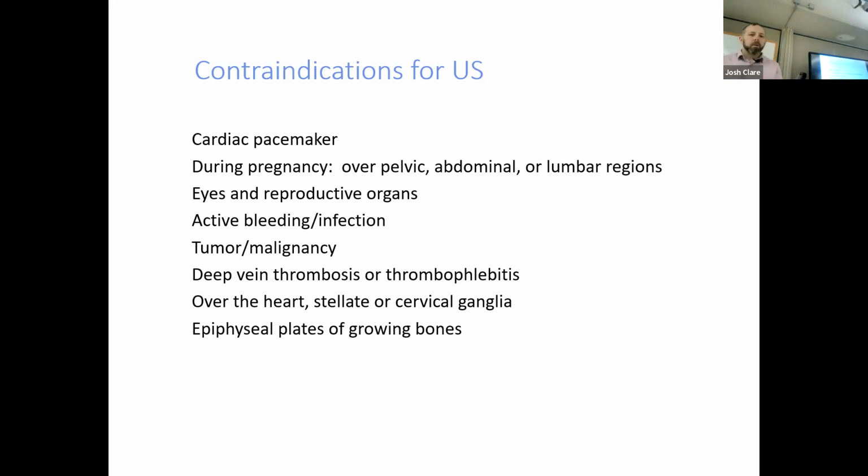Over eyes or reproductive organs, any active bleeding or infection, tumors, malignancies, always deep vein thrombosis, thrombophlebitis. Over the heart, I don't know what the stellate is. You guys know what that is? I learned it last year and then did not look at it again this year. Over epiphyseal plates over a growing bone. So the kids, we want to stay away from it as well.